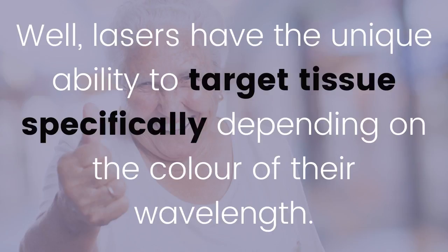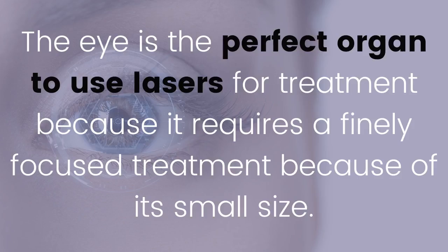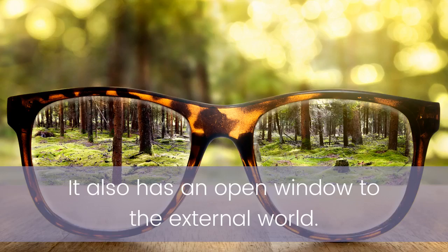Well, lasers have the unique ability to target tissue specifically depending on the color of their wavelength. They can also be fine-tuned and adjusted to burn, disrupt, or sculpt tissue. The eye is the perfect organ to use lasers for treatment because it requires a finely focused treatment because of its small size. It also has an open window to the external world.